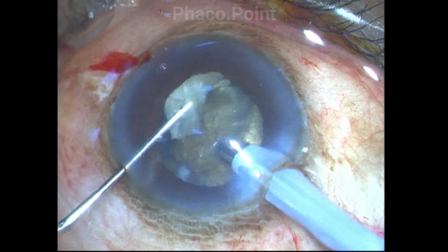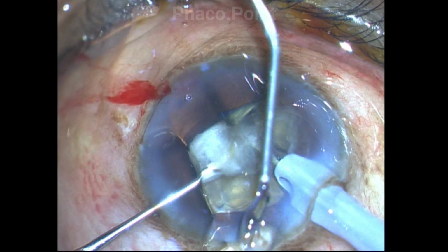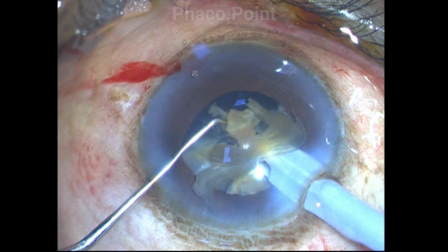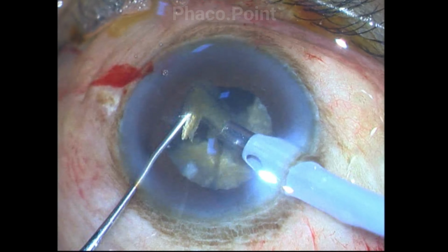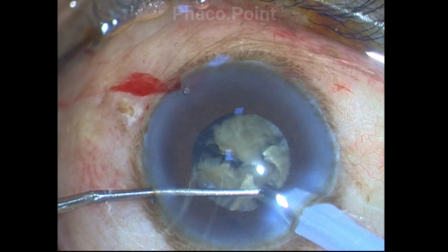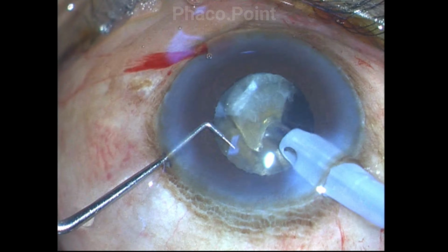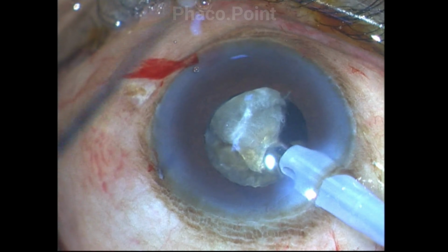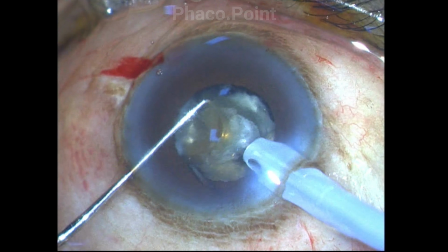With this fragment you can see a little bit of the thickened epinuclear sheath that has also come up, which is emulsified in foot pedal 2. Please note that some of these fragments have quite sharp edges, but I do not believe that they actually endanger the posterior capsule. With significantly fewer fragments left to emulsify, the surgeon now replaces the sharp long chopper with a Sinskey hook, thereby affording a lot more safety to the residual fragment emulsification.